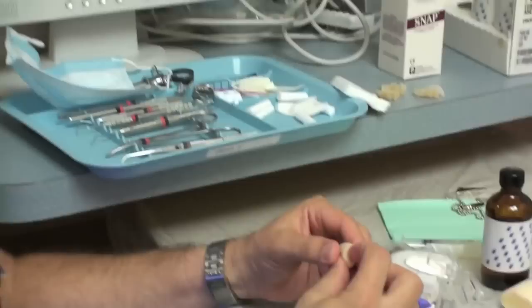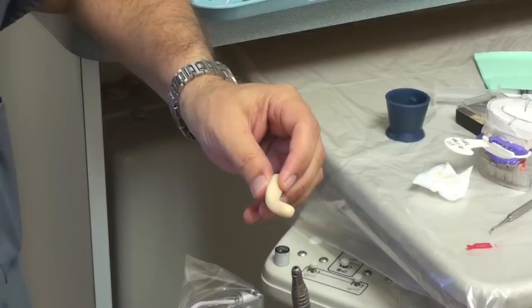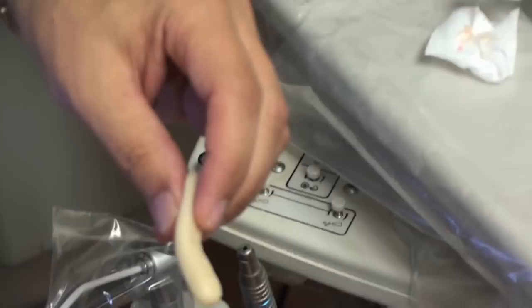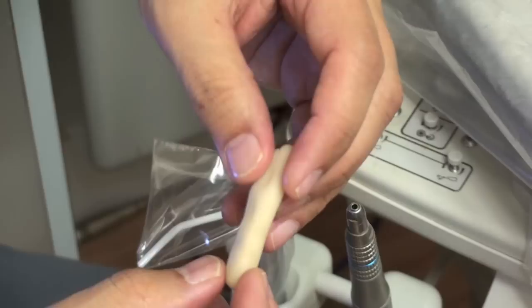You have a little contest running here. If you take it out too late, it's going to get hot and burn the patient. If you take it out too soon, it's going to distort and you're going to be back to where you started from. When in doubt, take it out sooner rather than later. Notice it's starting to get to the rubbery point where when I bend it, it's coming back to where it was before — but if I push my finger in, it's still way soft. In the patient's mouth it's going to set faster because the heat there accelerates setting. You have to err on the side of caution — I would rather you take it out too soon and redo it than wait too long and burn the patient or have it lock on.